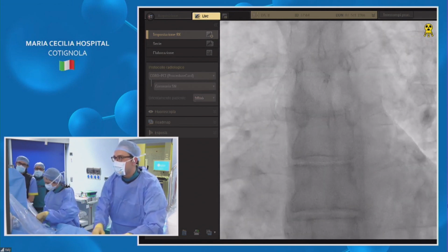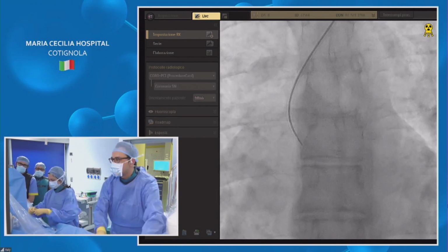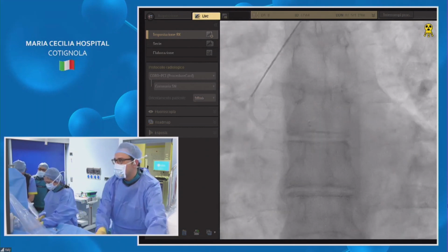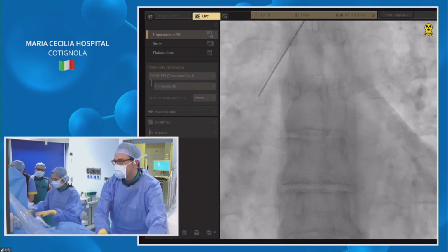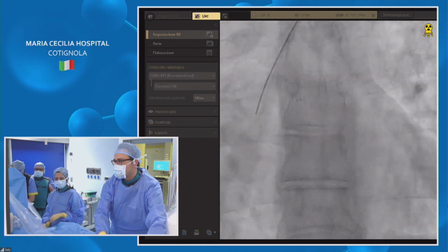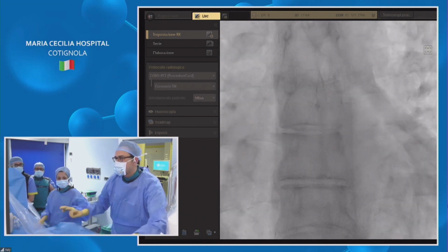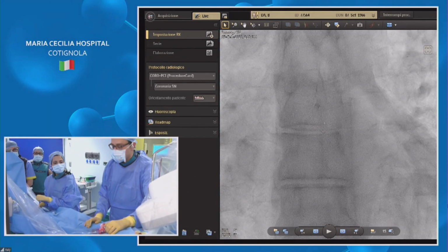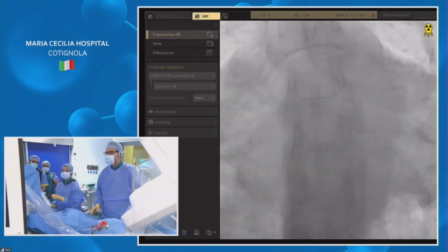What do you think about the expansion of the stent? Is it enough at 3.5? I think it's enough. But what is the MLA which has been achieved? I think it looks all right, but if we know the MLA, we'll know whether we. Check. The MSA, if we can calculate.